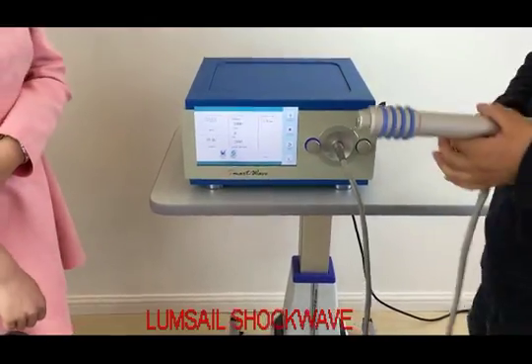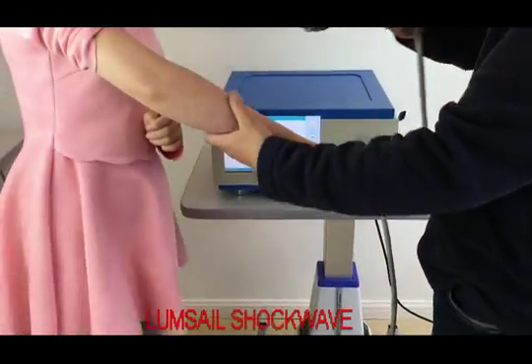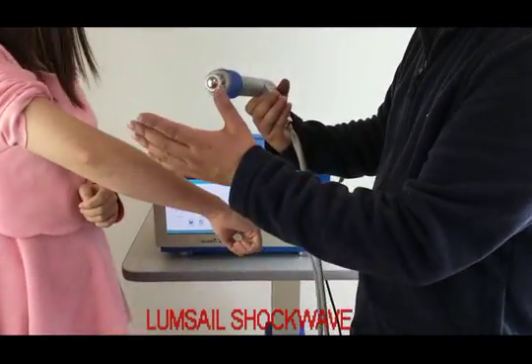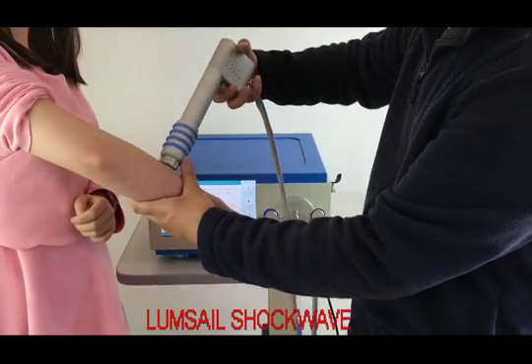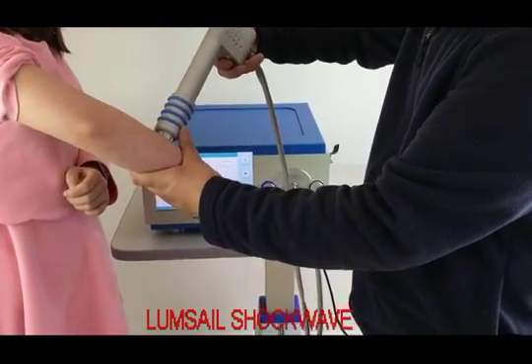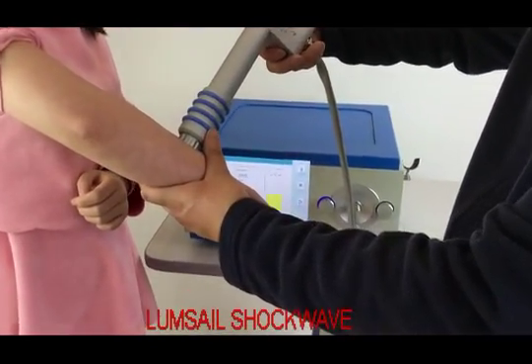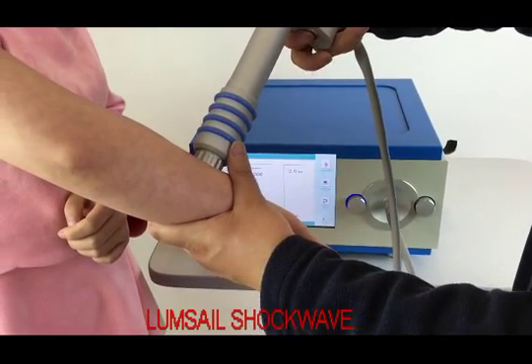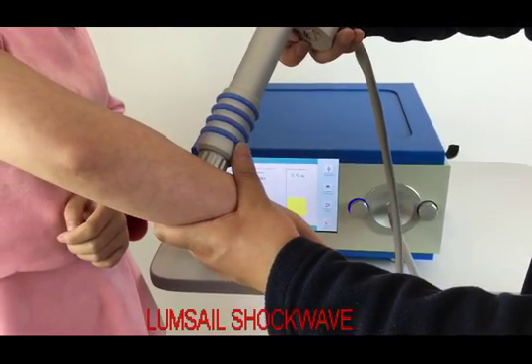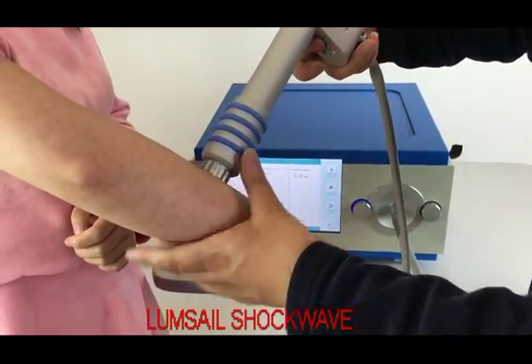Amy is our assumed patient. Before treatment, we need to ensure that the transmitter is installed firmly. We press down the trigger button slightly — it will shoot slightly. If we press down heavily, it will shoot continuously. Press again to release, and it stops.